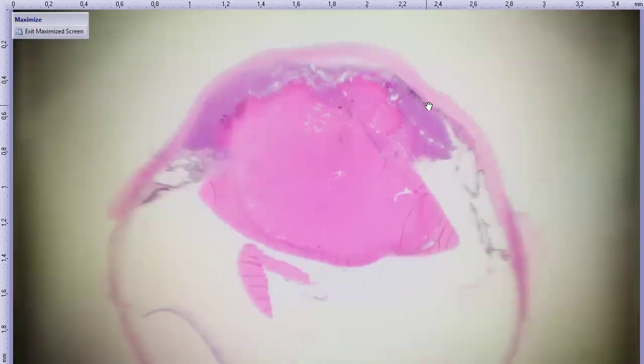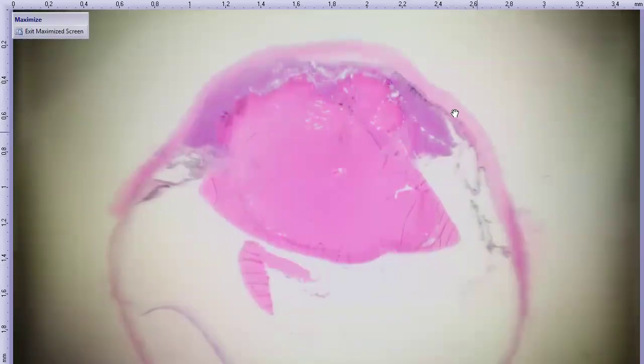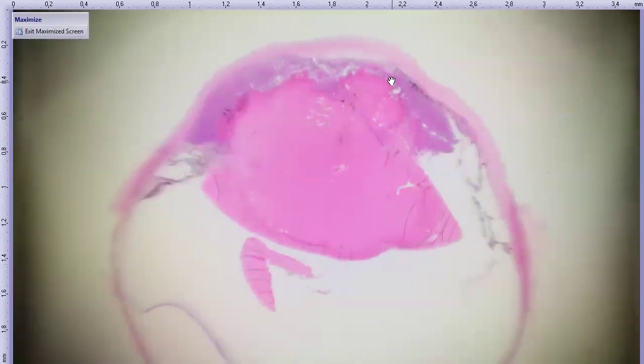Again, we can see that pigmented tissue, that's iris tissue, contacting the back of the cornea. And we can see our lens, the front of the lens is a bit irregular, and you can see lens fibers coming out of the lens. Here is our retina back here, which looks a little bit atrophied on this one portion, and our optic nerve.